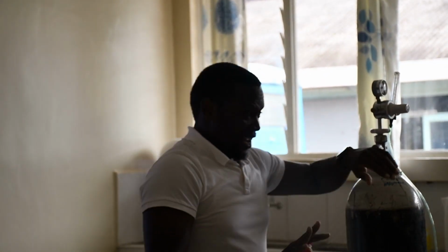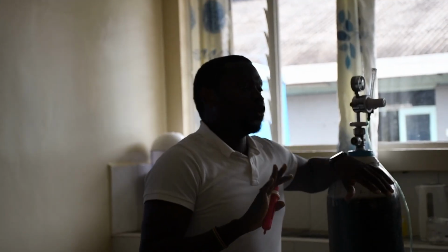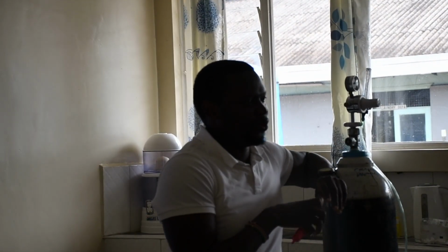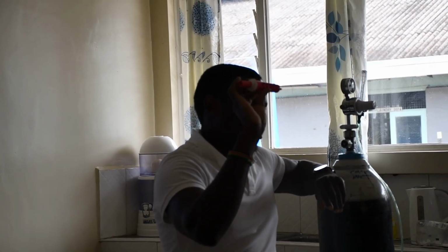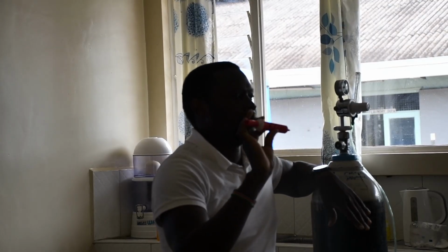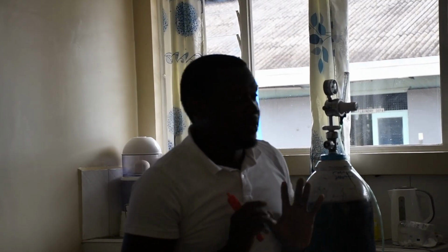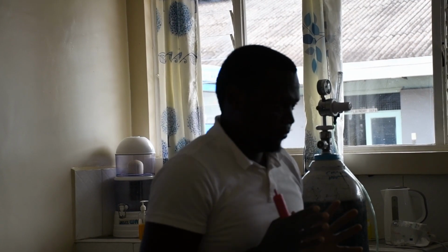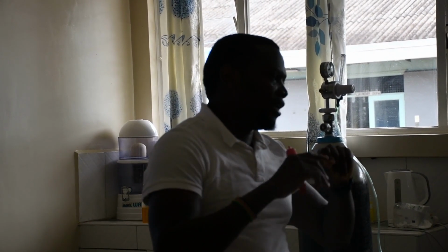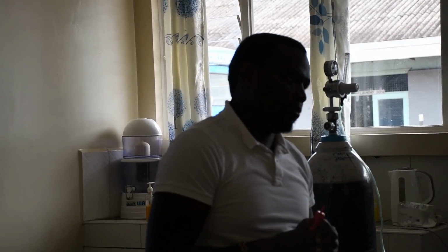According to the Kenyan guidelines, you should not do that when using a bubble CPAP system. This is a high flow system. When using this high flow system, there is no time that we should find your blenders closed down. The maximum that your blenders should go to is around 60%. You can move towards 70%, but that is a very critical decision to be made.